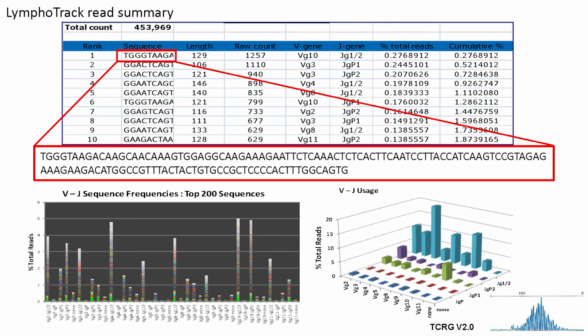When you're looking at a polyclonal sample, it looks more like this. So all the specific sequences, but nothing that is actually restricted to a specific rearrangement. So in this case, what you see is multiple bars in here with different colors.